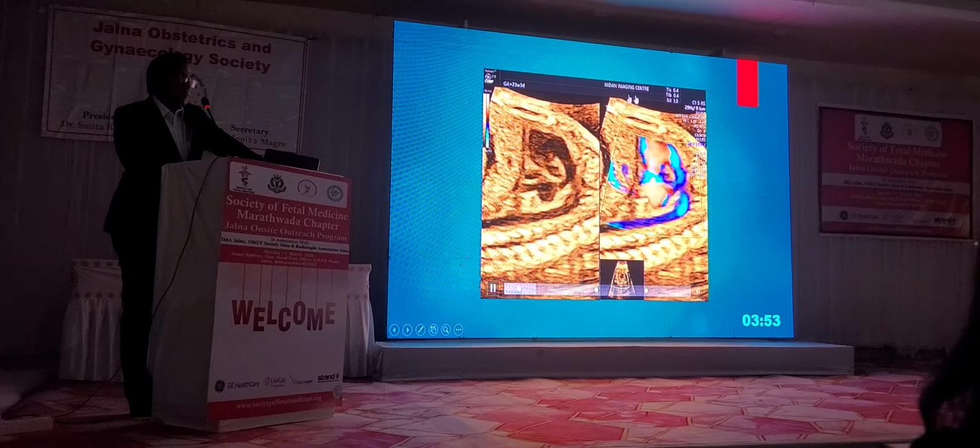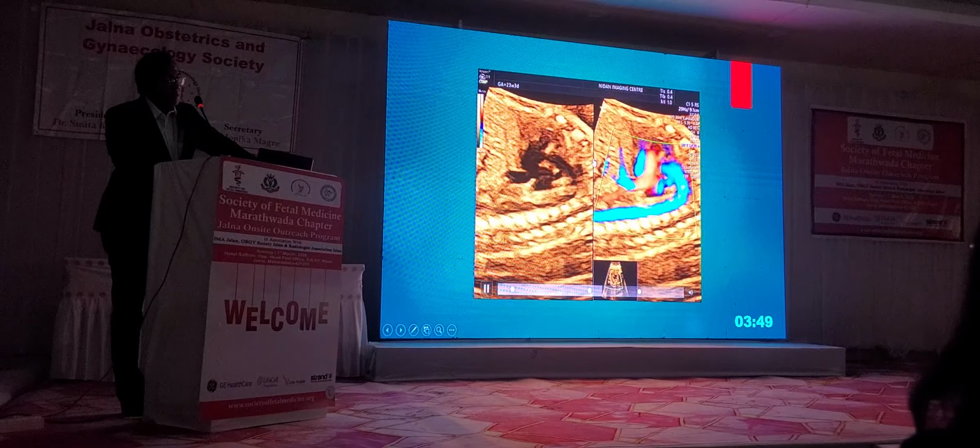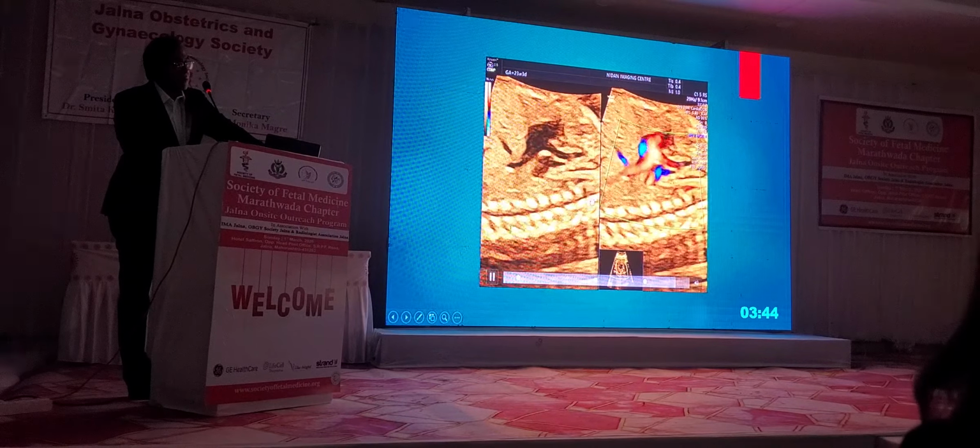I thank Dr. Vishnu for this beautiful clip. The sweep started with the ductal arch, this is the aortic arch, and finally we have come to the bicaval view.